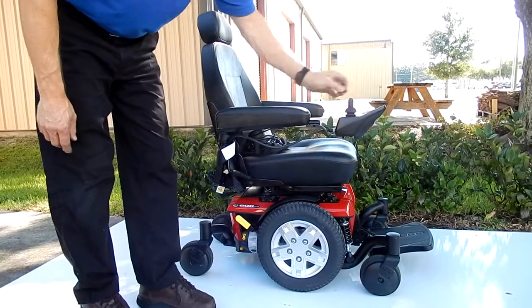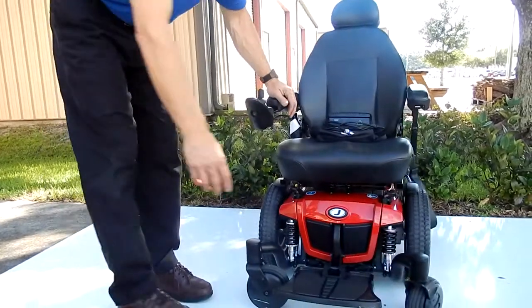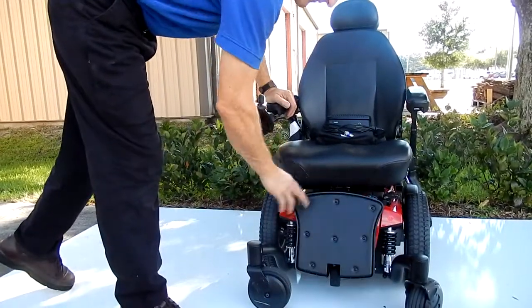This chair has six wheels on the ground, and it's very easy to drive. It has a foot plate in front that can be adjusted up and down for easy access.